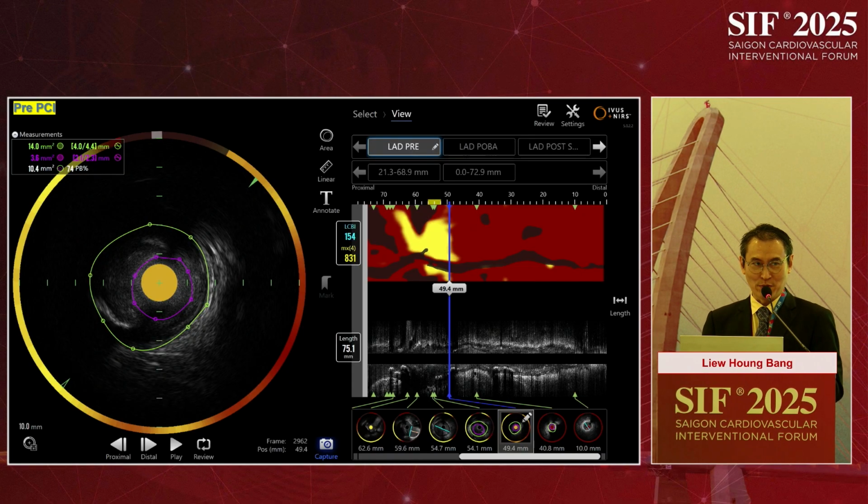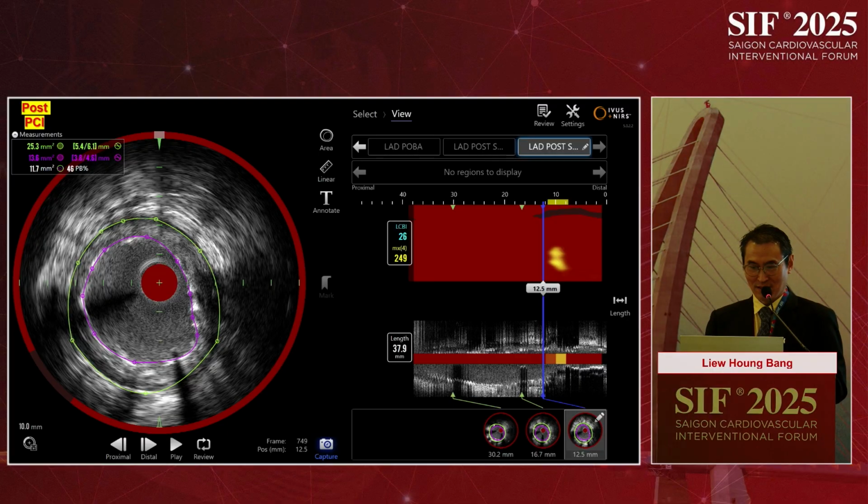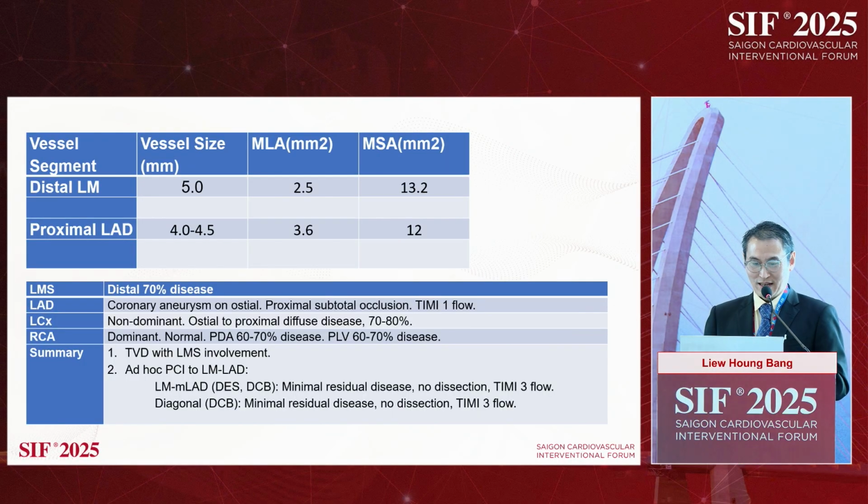But when we look at the lipid there, we're cutting at the lipid. So this is where there's additional value to tell us maybe we should not land the stent where that lipid is. We should try to cover that lipid. Okay? So there's some of this technology which we need to evaluate.